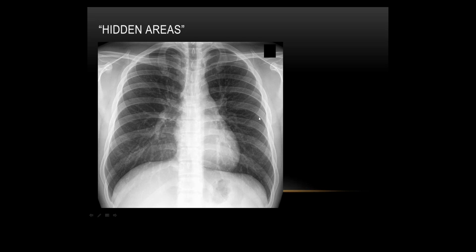Can I ask another question? Sorry. When is it appropriate to request a lateral view of the patients? Rarely nowadays. The reason being is the advent of low-dose CT. So I, every now and again, do request a lateral chest. I'll do a follow-up lateral chest X-ray.